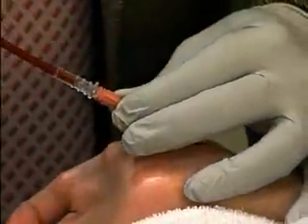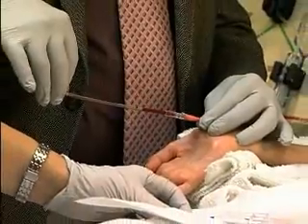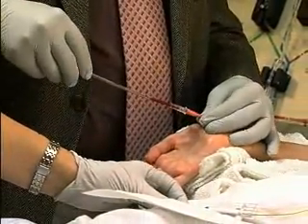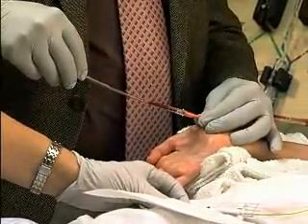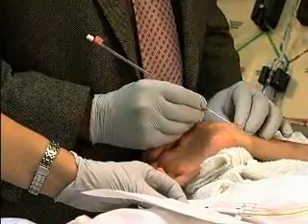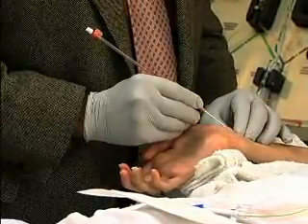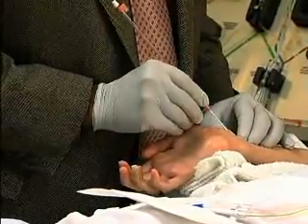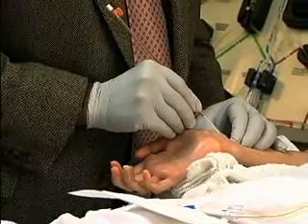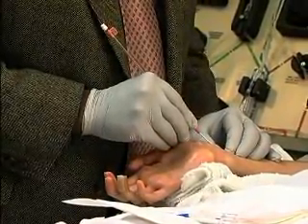And as soon as the artery is punctured, I can see there's a gush of blood in the catheter. And as soon as I see that, I hold the needle very steadily with my left hand, and I advance the guide wire with my right hand into the radial artery.